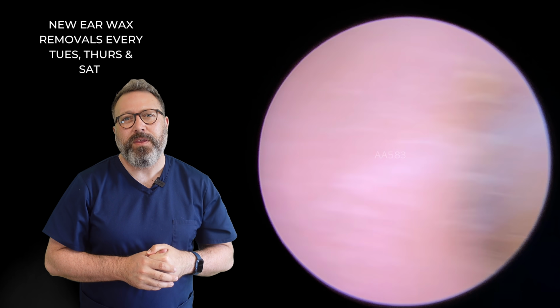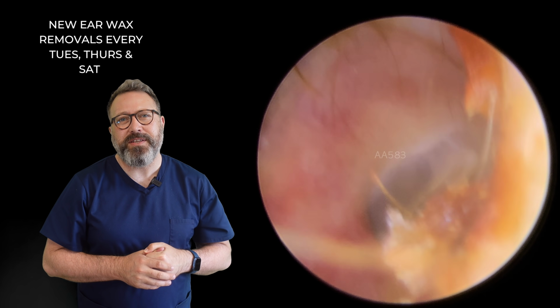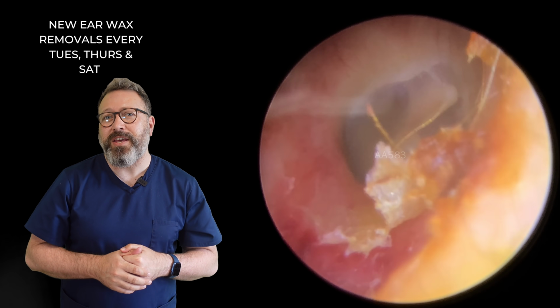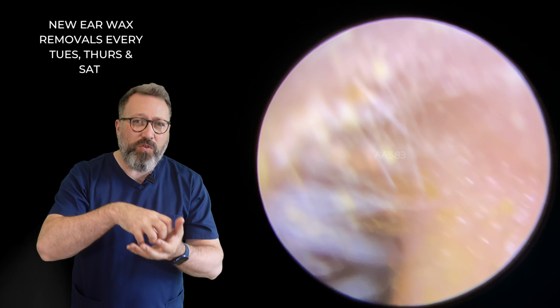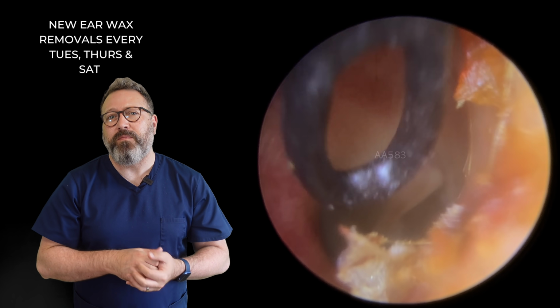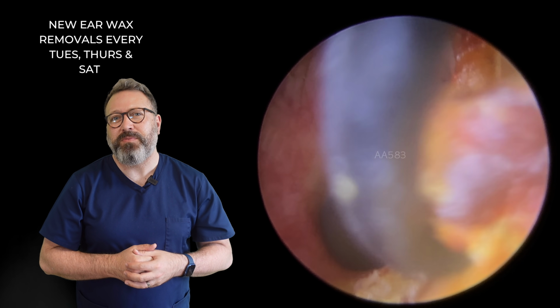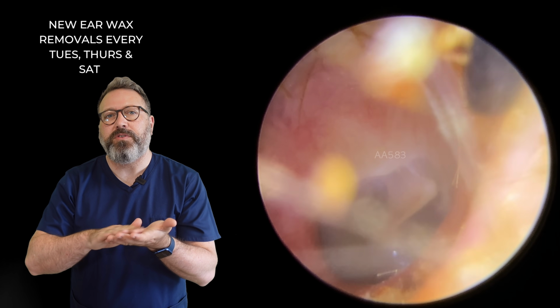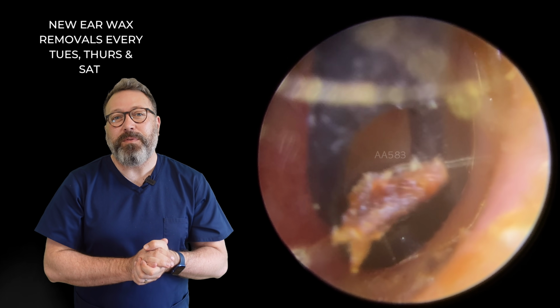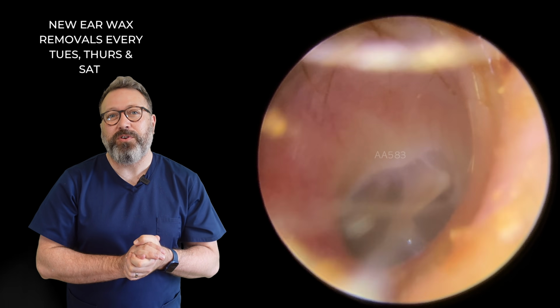There we go. Now if we take a look behind that, we can see there's a little touch of dry skin. Eardrum looks really, really good there though. A little bit of redness there, understandable, because it was so firmly attached to that canal wall. Patient hasn't had a chance to put any olive oil in there. But as we detached that, it took some of that dry skin, all the little blood vessels come to the surface. It's not bleeding, it's just everything's a little bit pink and aggravated. Give it a couple of hours, that will settle down and go back to its normal look as well.